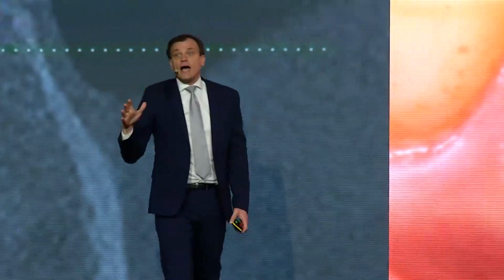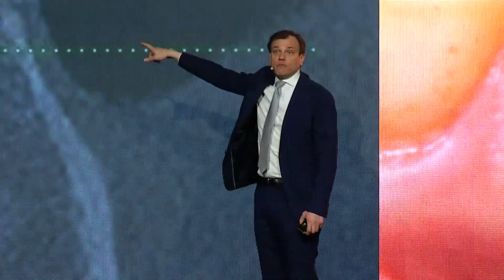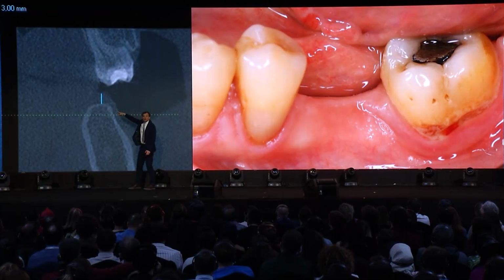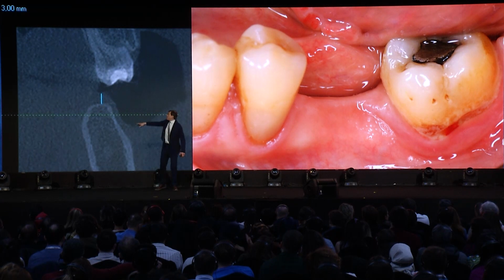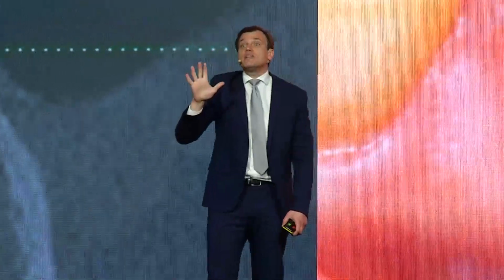So all my treatment planning begins from this measurement, and then I know how I can place my implant, the depth. We started this study in 2018. So at that time, remember, I was still thinking that 3 millimeters is completely okay.